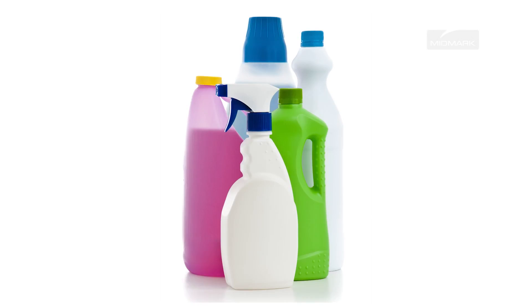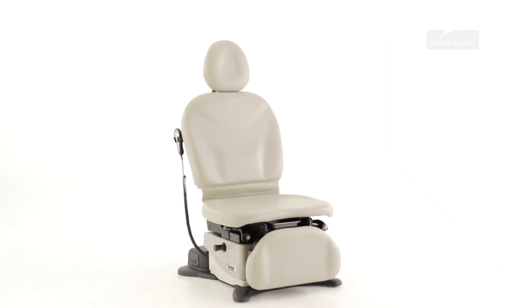All disinfectants and cleaning agents damage your table upholstery to some extent. However, it is our goal to give our customers guidance that supports a long product life. Your MIDMARK upholstery will provide your facility years of service if you follow these guidelines.